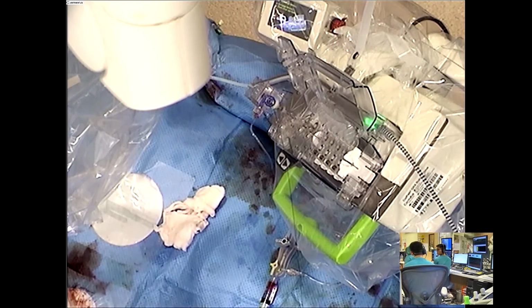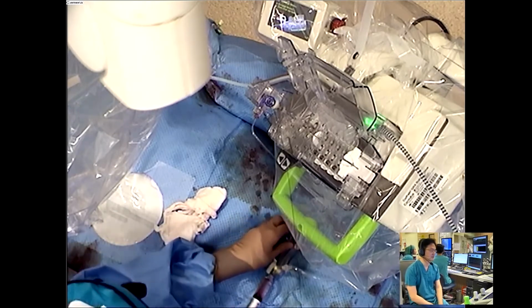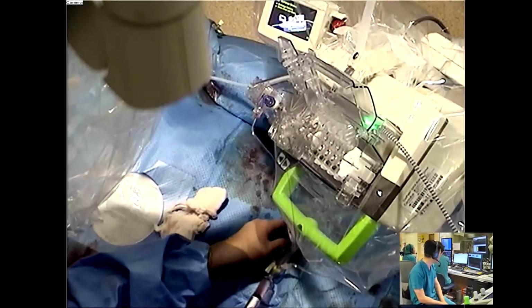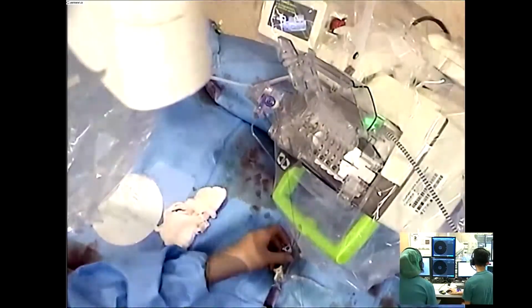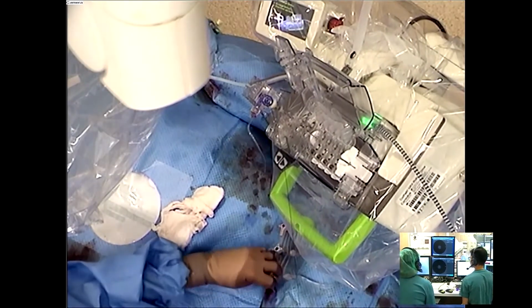So you want an angiogram first? Yeah. Okay, so Deborah, you want to give some nitrate, maybe? Blood pressure is a touch low. You know, maybe start a bit of fluid. Okay, so maybe no nitrate, and just take a picture first for us.